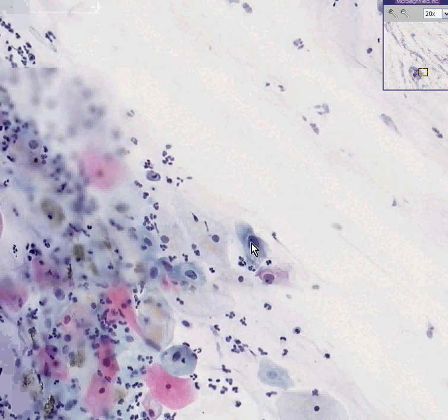And there's another classic example — you won't get anything much worse than this. So this is another case of LSIL, low-grade squamous intraepithelial lesion. Thank you very much.